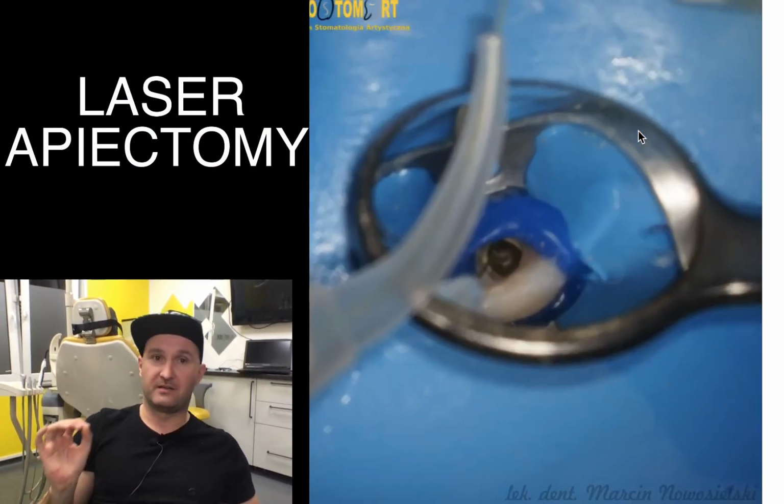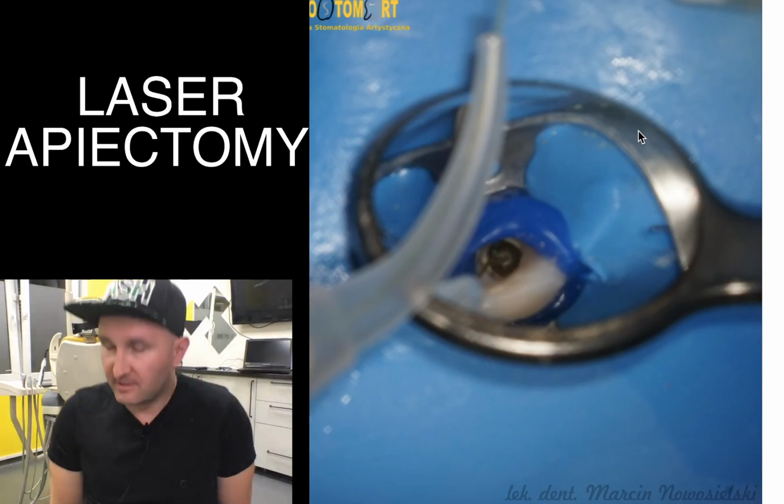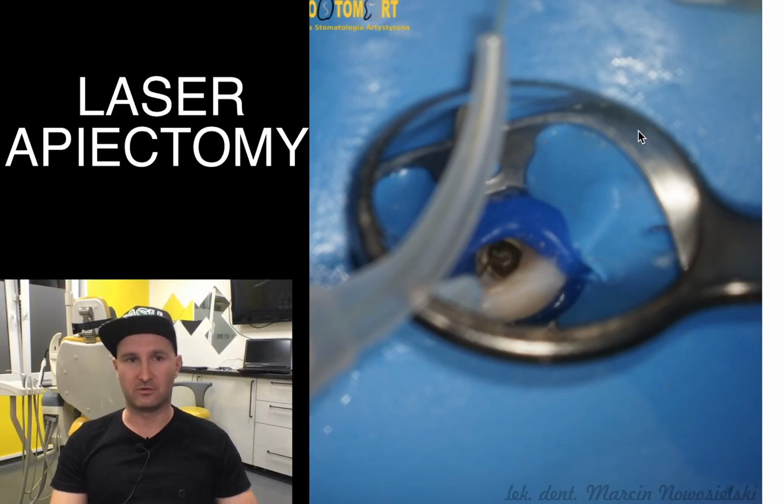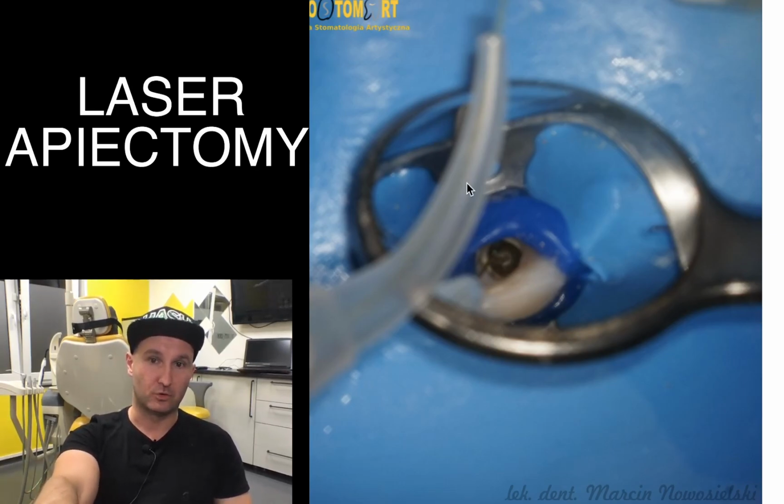dentinal tubules. In fact, the sodium hypochlorite penetrates, I guess, about 1/10 of a millimeter inside the walls. The light of the neodymium laser penetrates about 1 millimeter deep into the root canal, so it makes our disinfection much more effective.